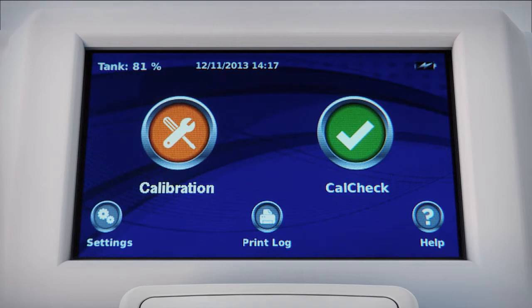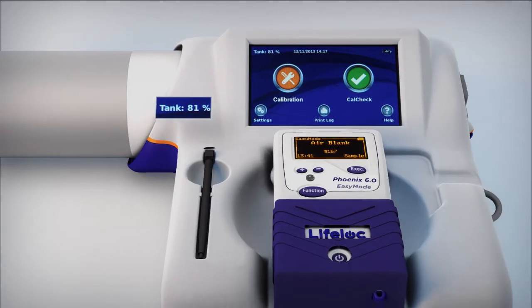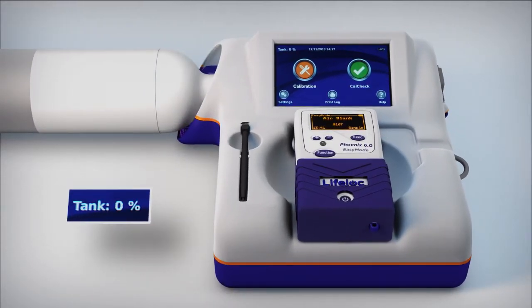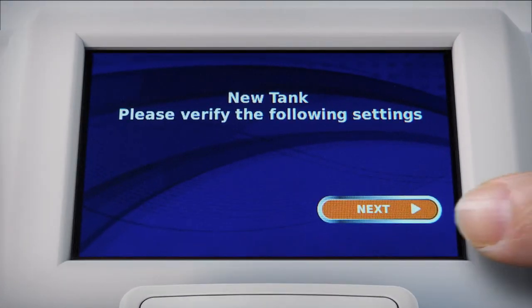EZ-Cal simplifies dry gas management and prevents non-compliant conditions before they occur. Plus, you can save up to 50% on gas usage. EZ-Cal digitally monitors tank pressure and expiration date, so you don't have to. You'll always know when a gas cylinder is running low, has expired, or needs to be reordered. EZ-Cal prevents instrument calibration when it detects an out-of-date gas.